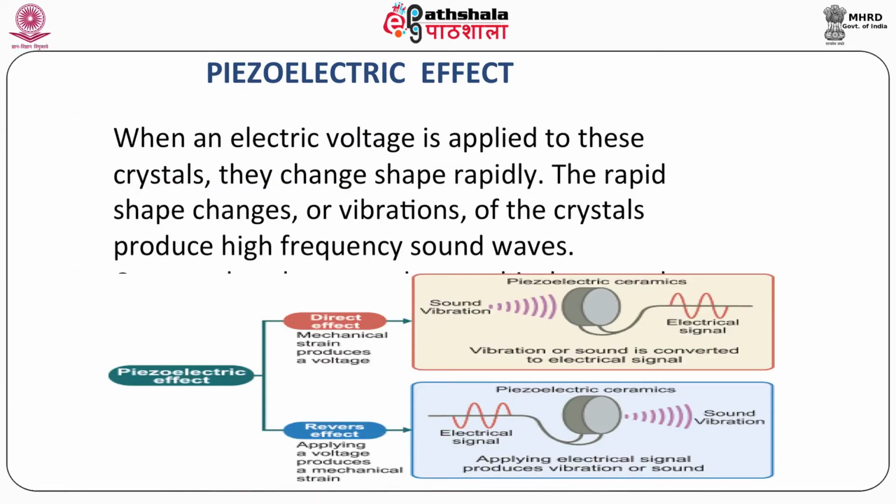Now coming to the piezoelectric effect. When an electric voltage is applied to these crystals, they change shape rapidly. The rapid shape changes, or vibration, of the crystal produce high frequency sound waves, as you can see here. Conversely, when sound waves hit the crystal, they emit an electrical signal back.